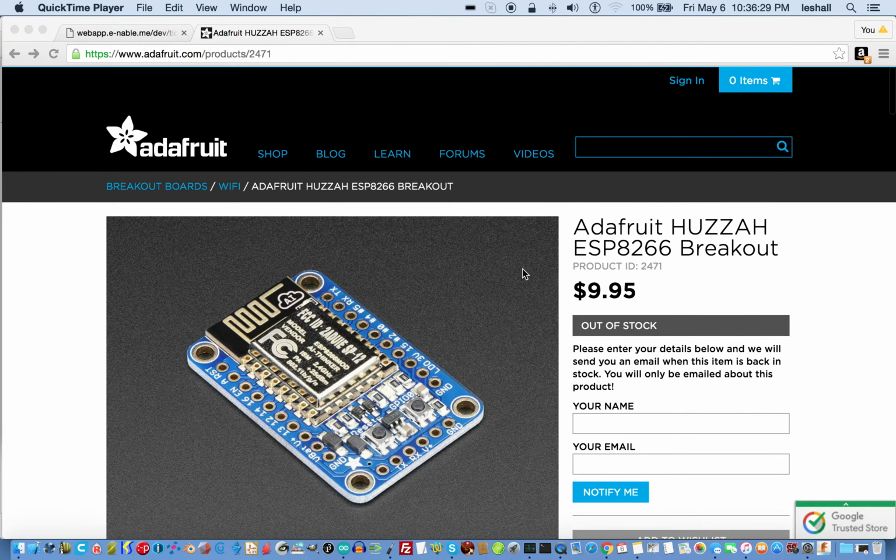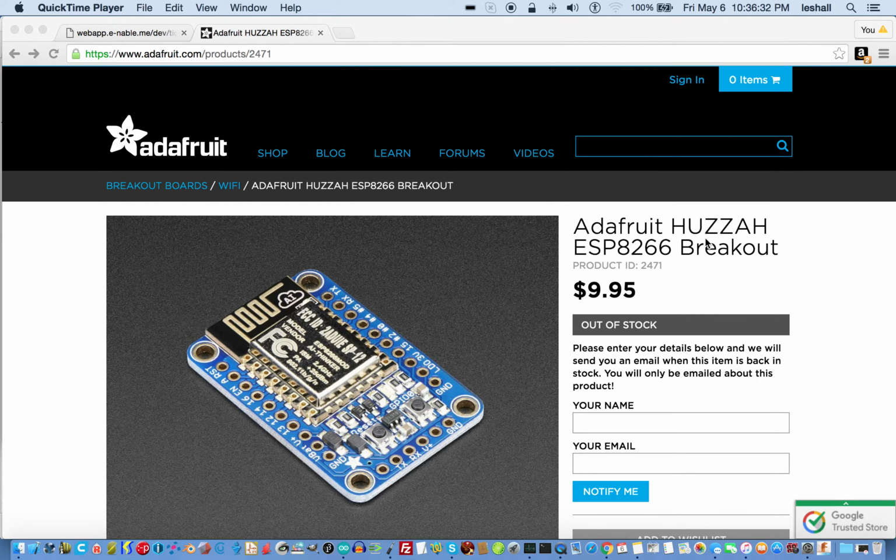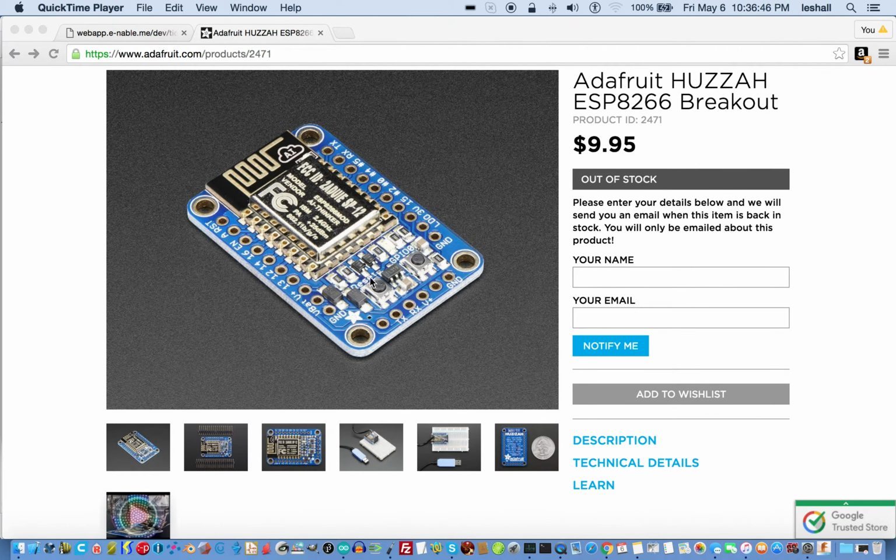We'll start off with our hardware, which is this Huzzah ESP8266 breakout board from Adafruit. It's only $9 and it's frequently out of stock, so put in your notification and get them when you can. Actually, we're going to be moving to the Feather platform next thing, but I want you to be able to duplicate my results precisely. So you got this board.